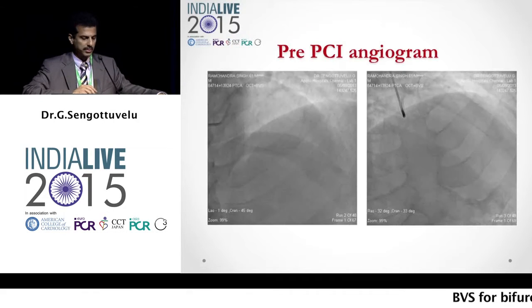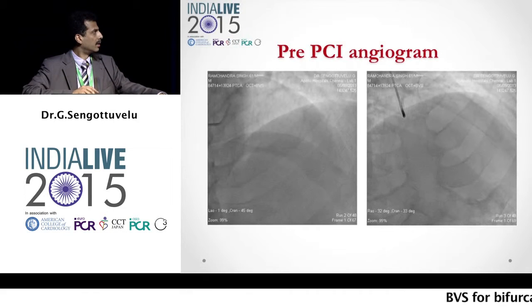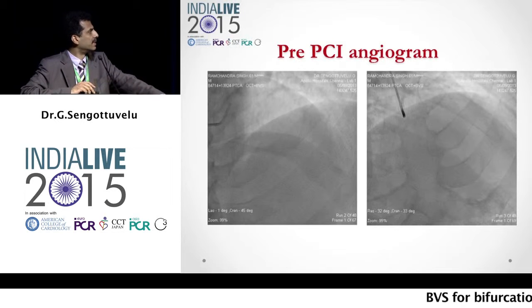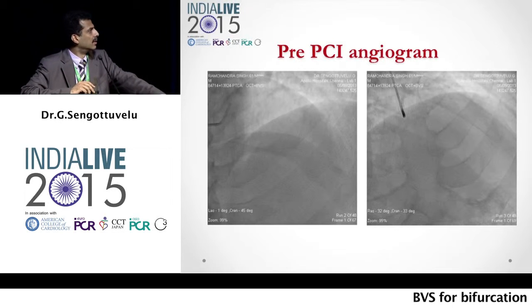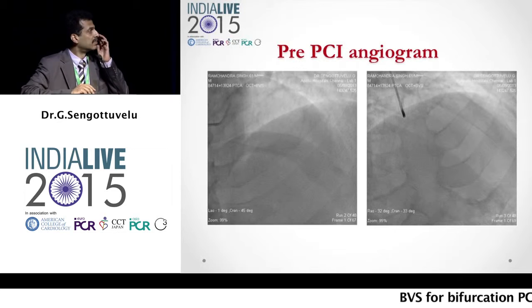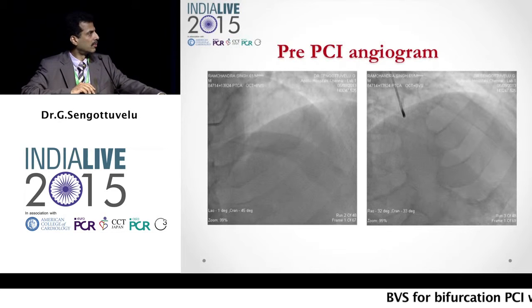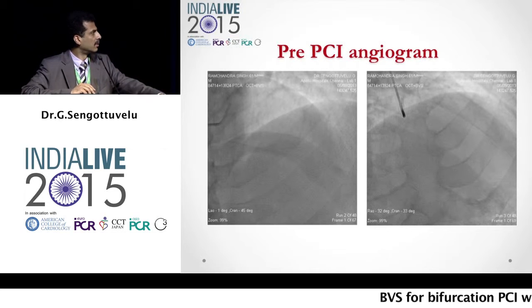So we had a LAD diagonal and also some disease in the ostium of the septal. We decided to treat this bifurcation using a bioresorbable vascular scaffold.